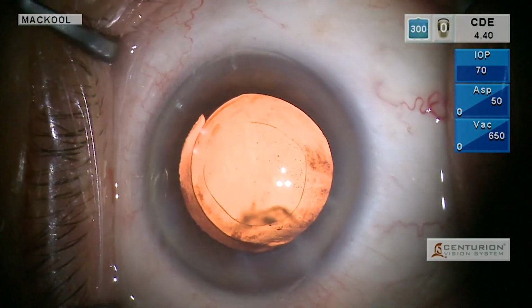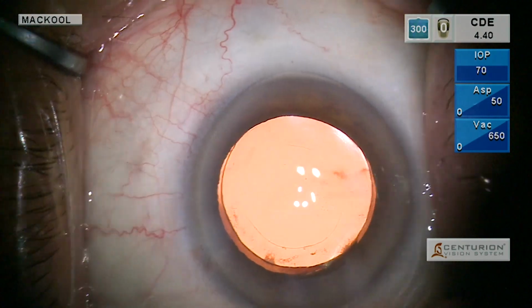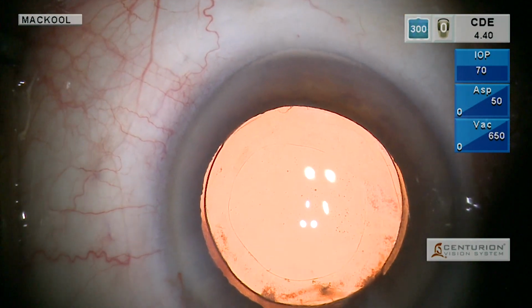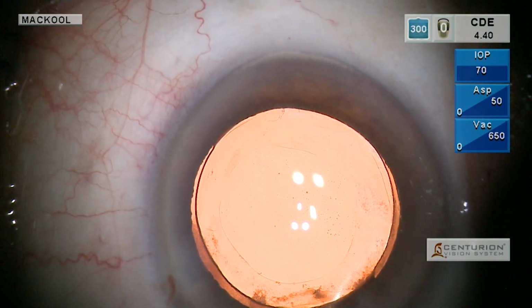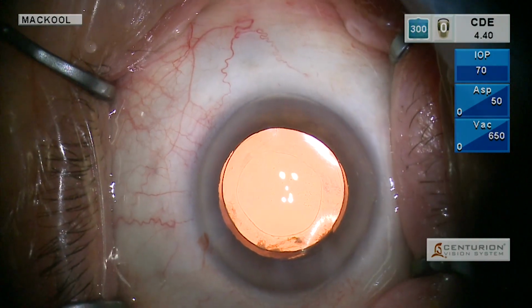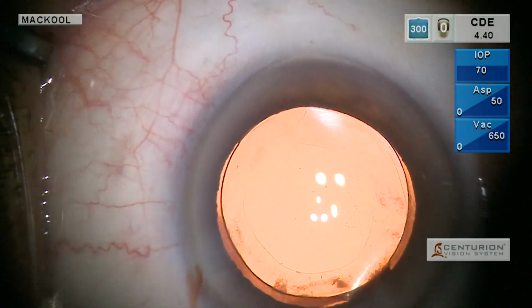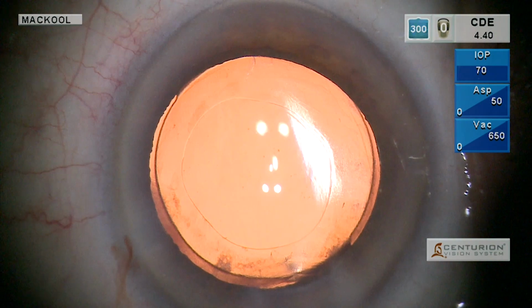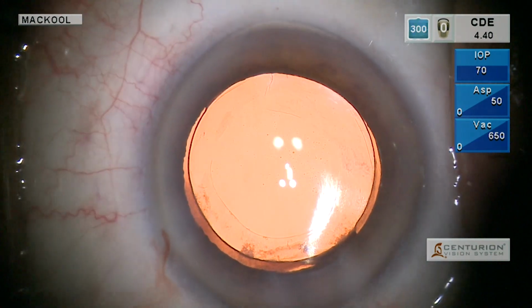Let's see if she can look down yet. Can you look down toward your shoes? There you go. Very good. So you can see it's a smallish rhexis, but that's my typical rhexis. Somewhere in the 4 millimeters, sometimes 4.6, but in that range is where I like to have it. You don't get any tilting of the optic when you're covered with the capsule on top of the optic like that, and that translates into no induced coma. And we're done.